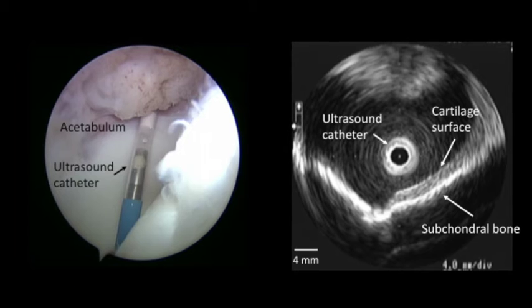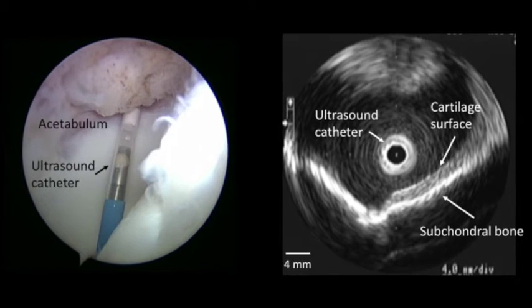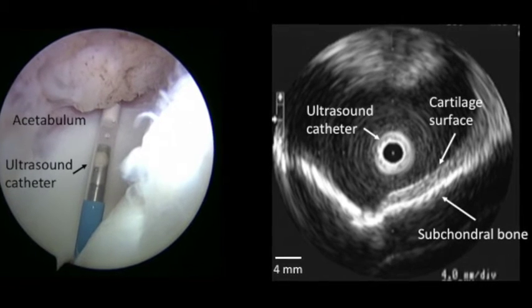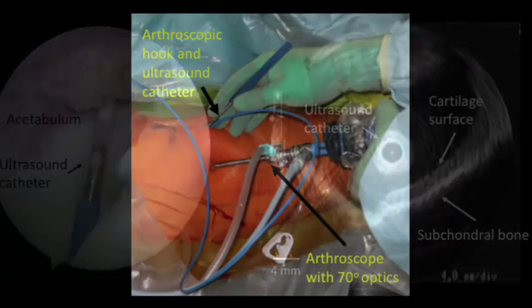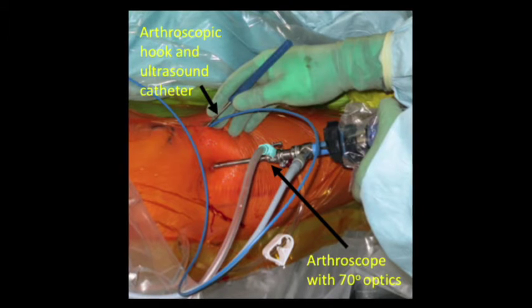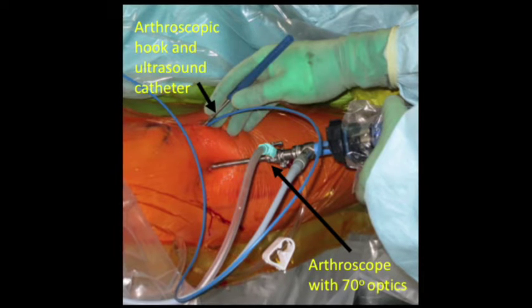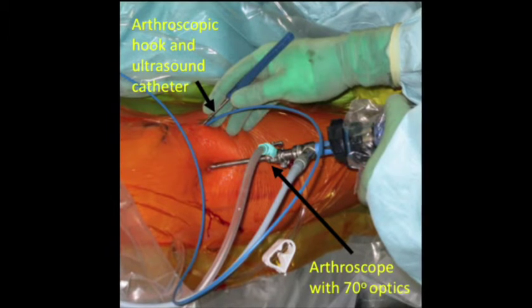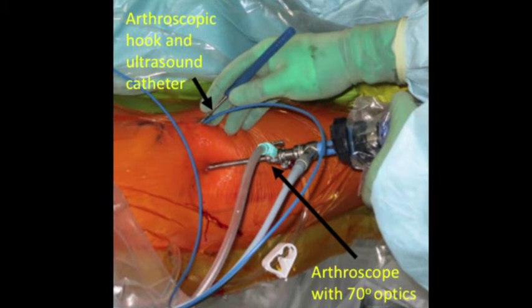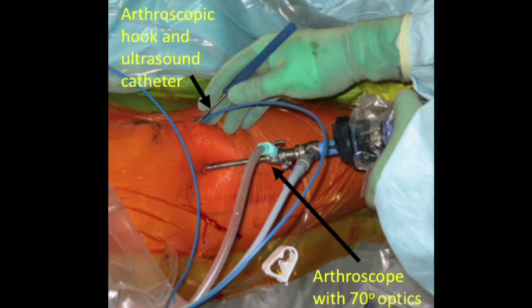In addition to assessment of cartilage surfaces, the evaluation of cartilage inner structure and subchondral bone, not accessible in conventional arthroscopy, is possible with ultrasound imaging. This right hip was arthroscoped for intra-articular evaluation, femoral head OCD debridement, retrograde drilling, and autologous bone transplantation of the OCD. Anterolateral hip arthroscopy portals were used. Interportal capsulotomy was decided to enable free instrument moving intra-articularly.